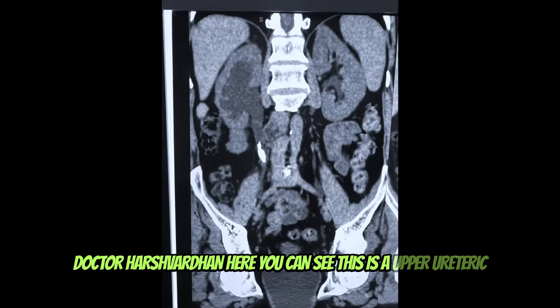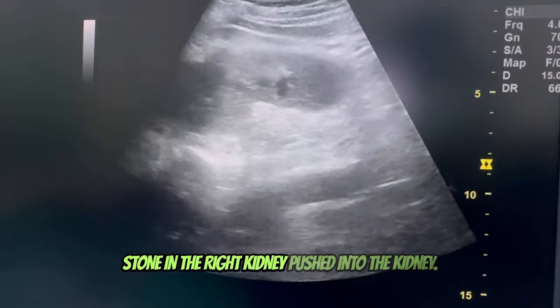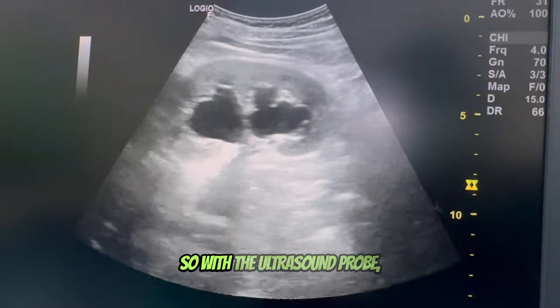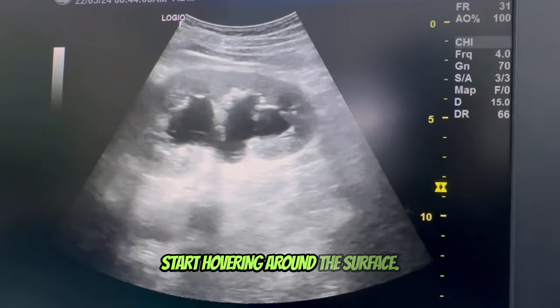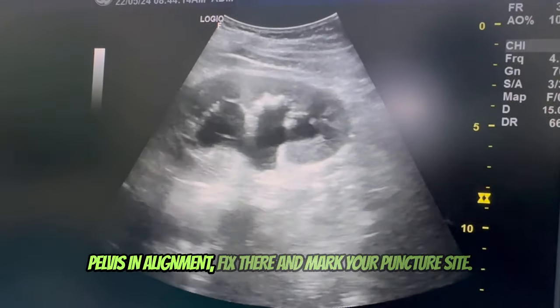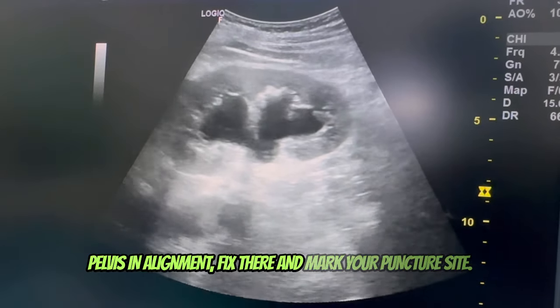Dr. Harshvardhan here. You can see this is an upper ureteric stone in the right kidney, pushed into the kidney. With the ultrasound probe, start hovering around the surface, and once you see this image of all the calices and pelvis in alignment, fix there and mark your puncture site.